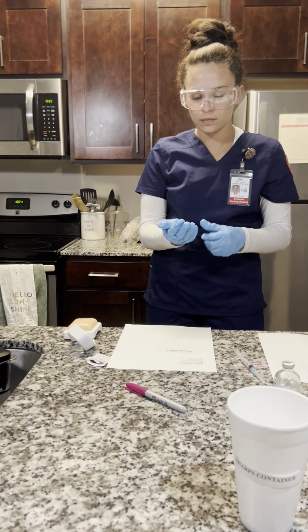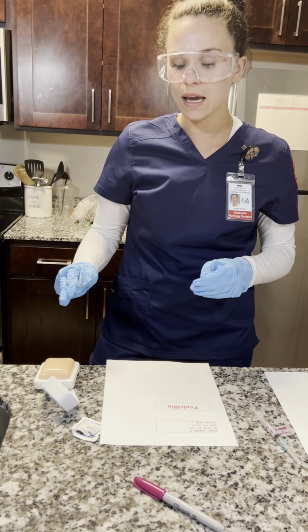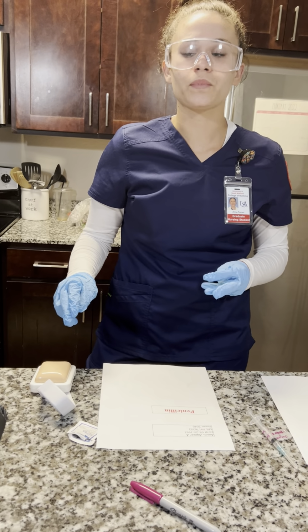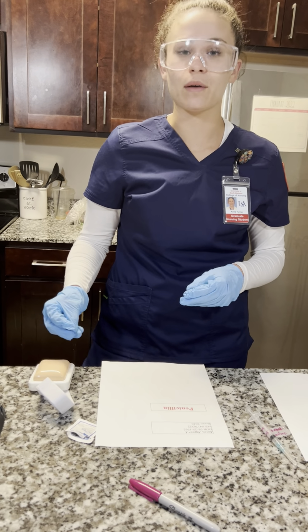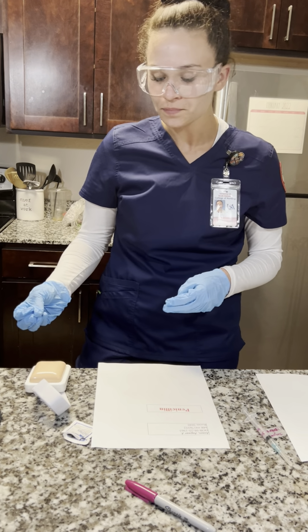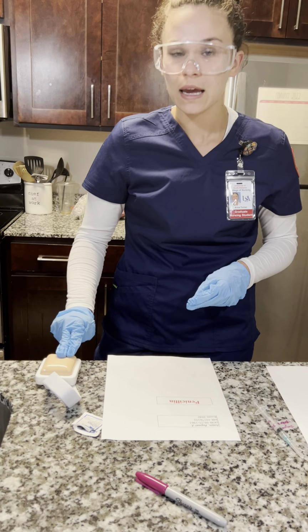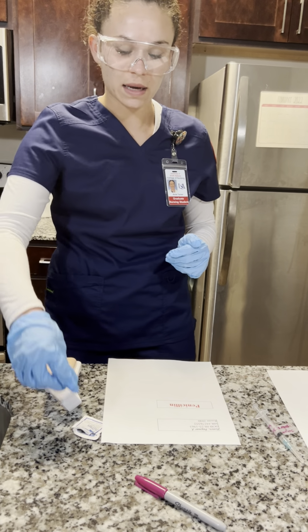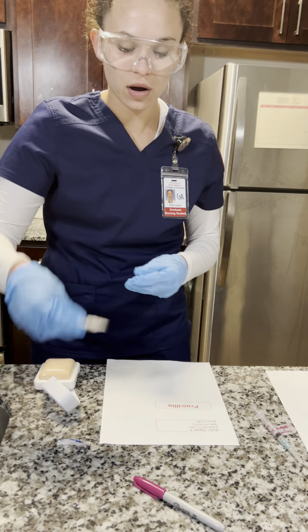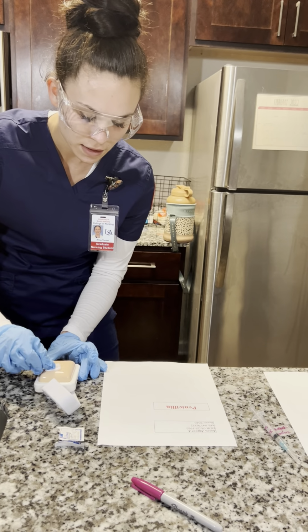Okay. And now I'm going to be assessing the integrity of the skin, and the location that I'm going to be using for the injection, I'm going to be finding that with the bony landmarks. So I'm assessing for any bruising or anything like that, and there is none. So now what I'm going to do is clean the area with an alcohol prep pad in a circular motion, like so.